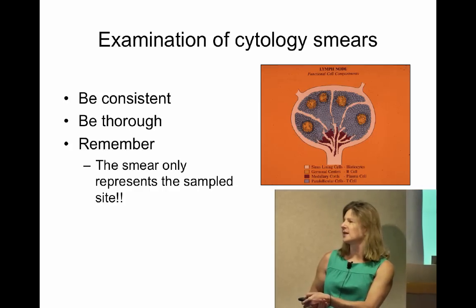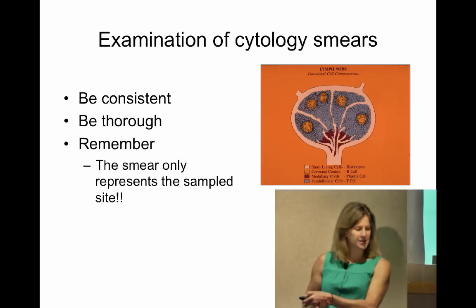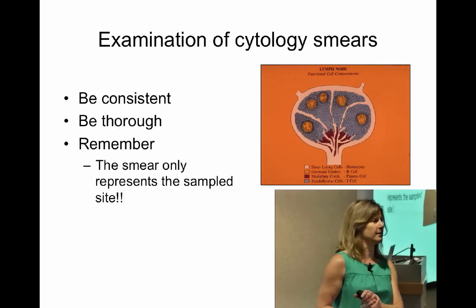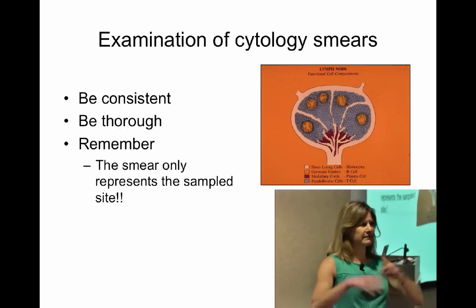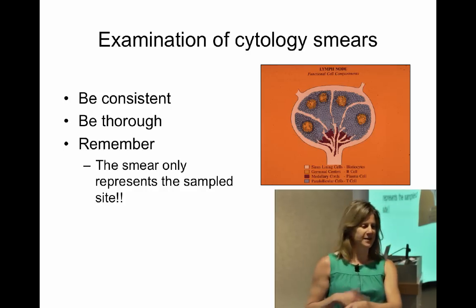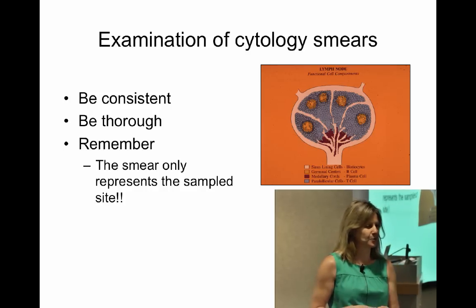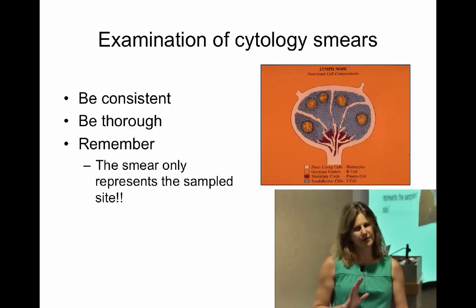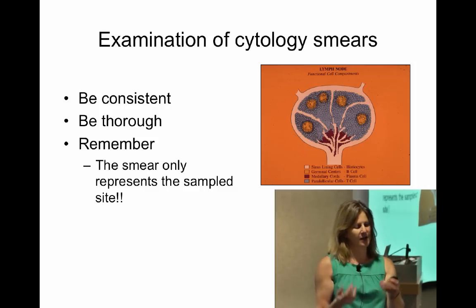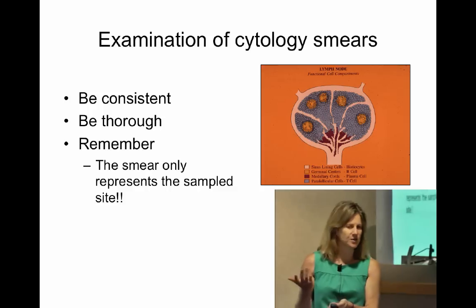I've certainly seen an aspirate of a lymph node going straight into the medullary sinus, where plasma cells and histiocytes and erythrophagocytic macrophages are all you're going to see, and you're like, oh my God. Then you get the cortex and you get lymphoid tissue, and then you go straight into a hyperplastic germinal follicle and it looks like lymphoma. So you've got to know what the tissue is and what the architecture of the tissue is that you're aspirating in order to recognize what's normal and what's not.